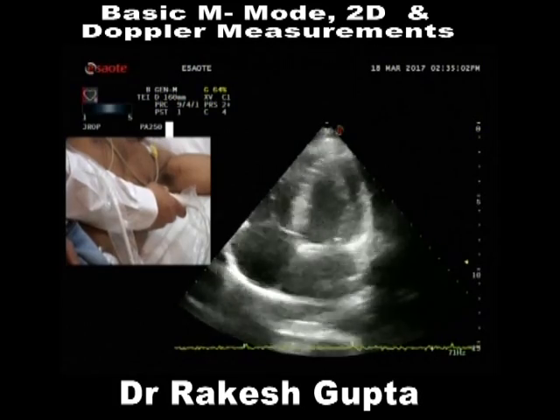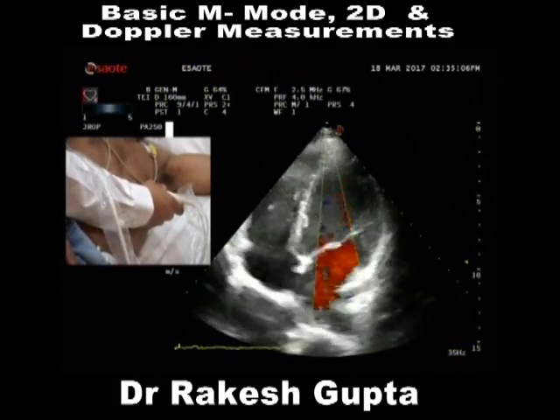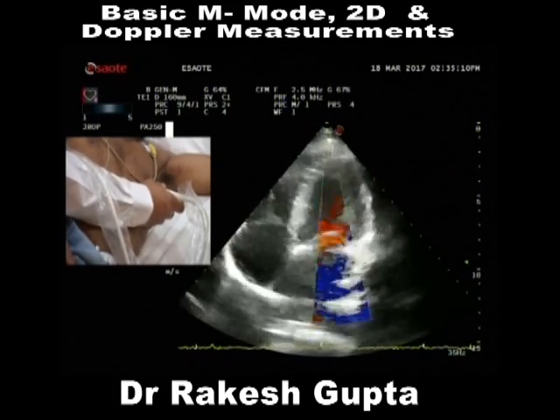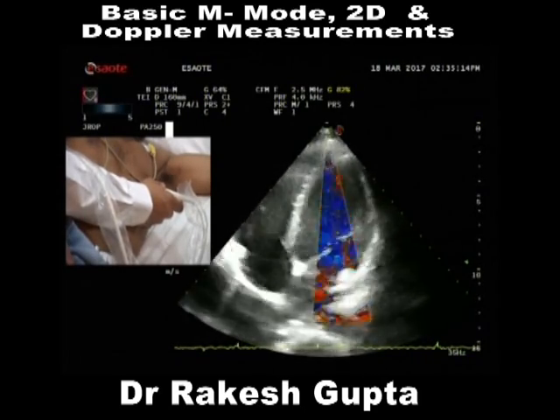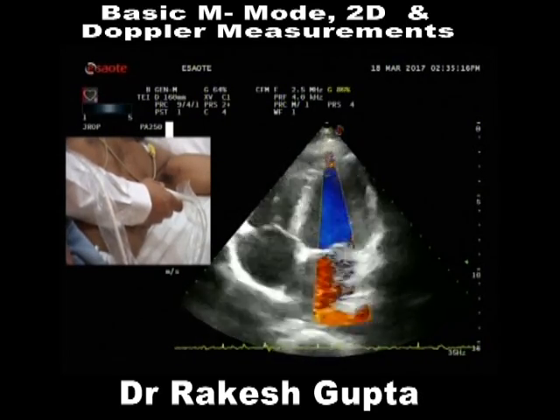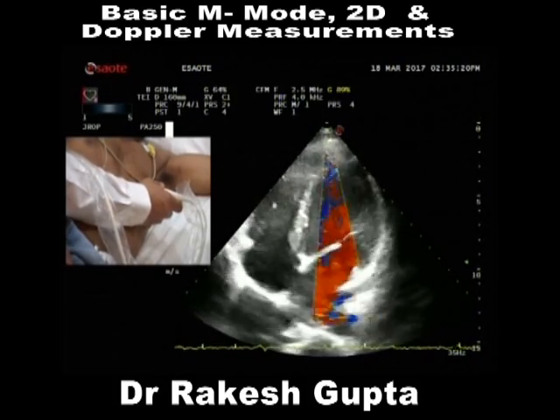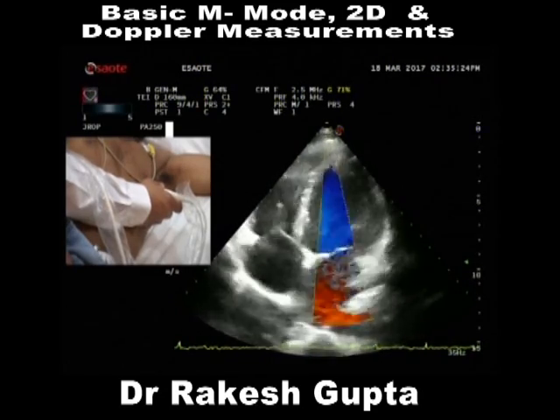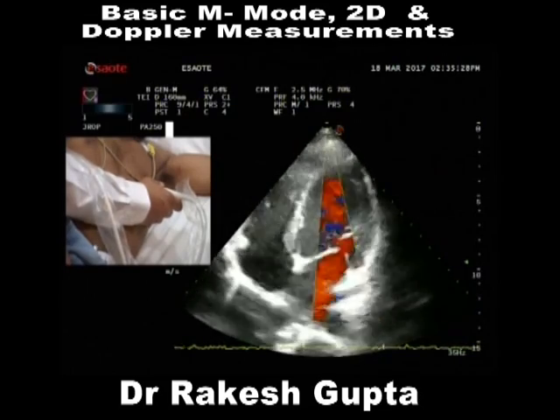So second thing is now color. Now how do you say my colors are optimized or non-optimized? I am going to increase my, look, I can see many colors out there. So I am going to optimize my colors. Still the garbage is gone away. Those speckles have gone away.